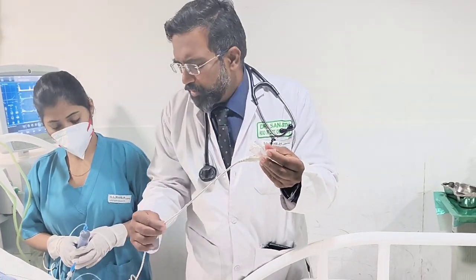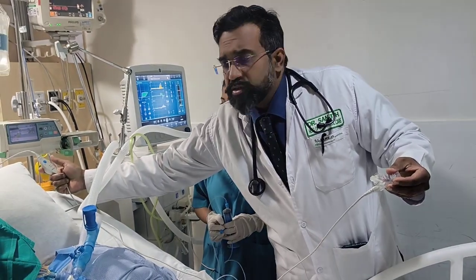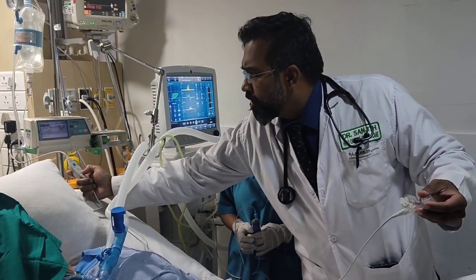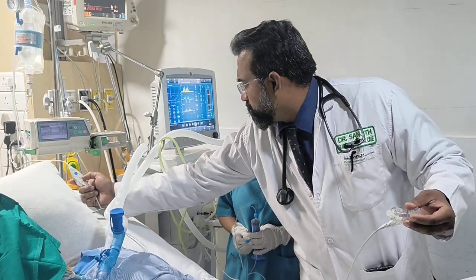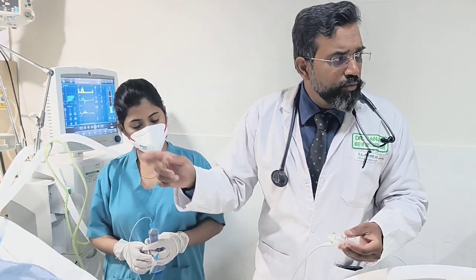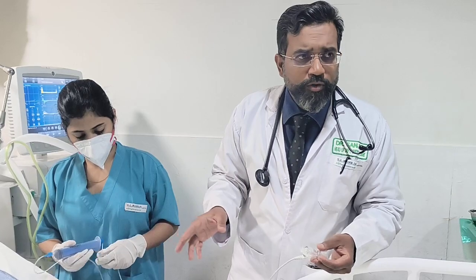There is a wire that goes from here into the connector, into this wire, which actually is the controller. This is the controller that says on and off for how many minutes you want: 30 minutes or 6 hours. So when we are going to nebulize, we can put it for 6 hours on that. We can stop after 2 hours.